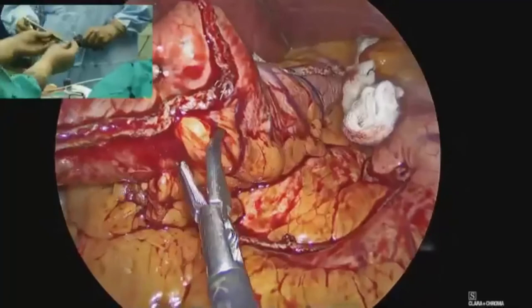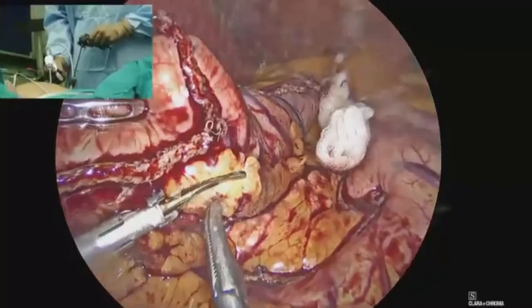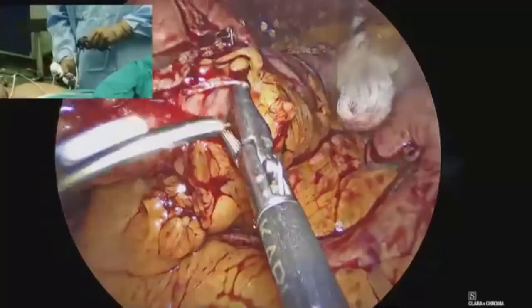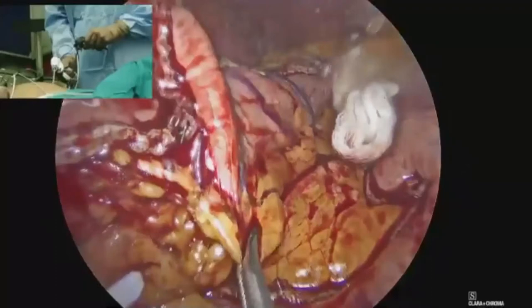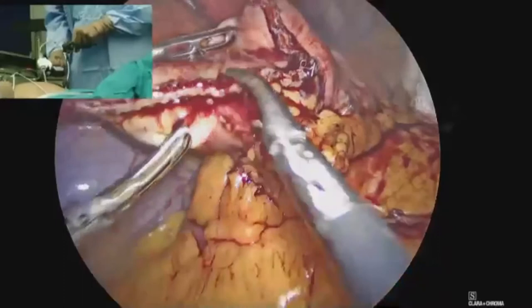You can see that we have a lot of fat here. I'm going to remove this fat, and dissection is done so that we do not encounter bleeding while we fire the staple here, because this fat usually is a little thicker than what we expect. Now, this is a gastrotomy I do posterior to the staple line. With the anesthetist helping to push the bougie in, we can see the blue of the bougie there. So that's the gastrotomy done.